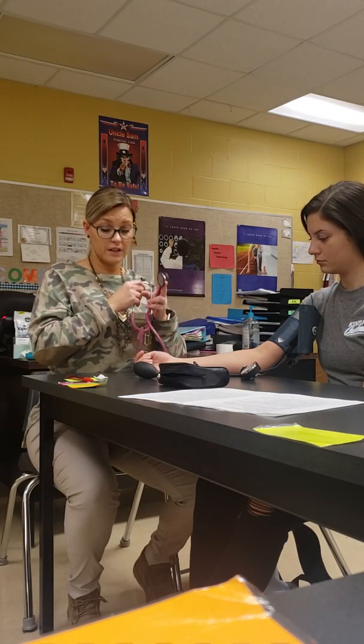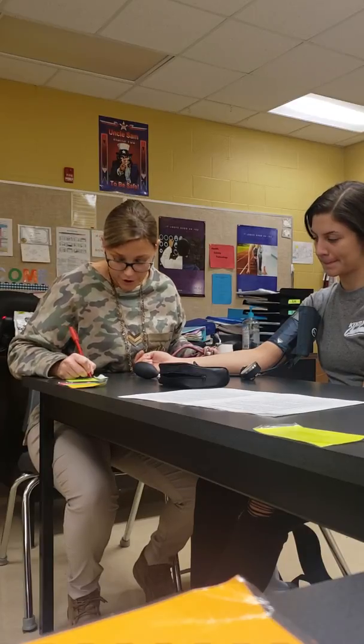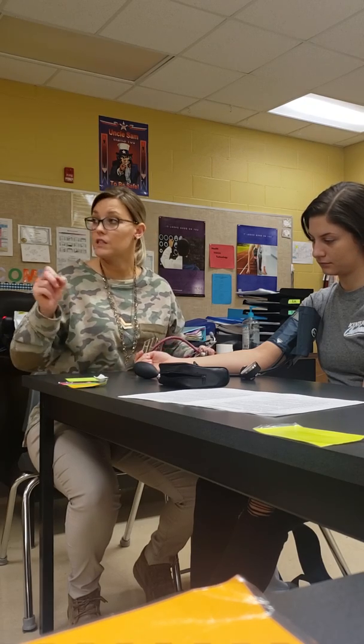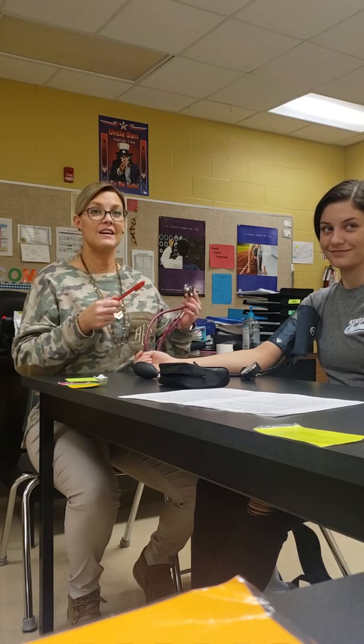As soon as I heard the last beat, I deflated it completely. I heard the first beat, which is your systolic, at 114. I heard the diastolic at 60. So it's 114 over 60, and you write it like a fraction. She's consistent. That's what I had whenever we were working together for her.